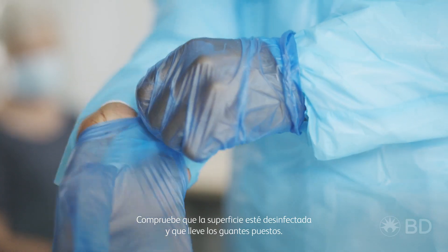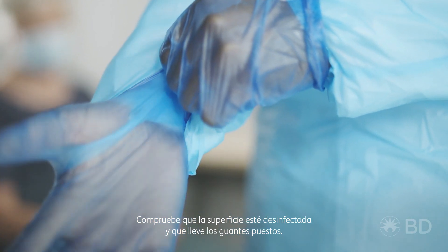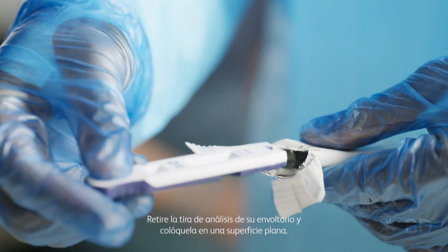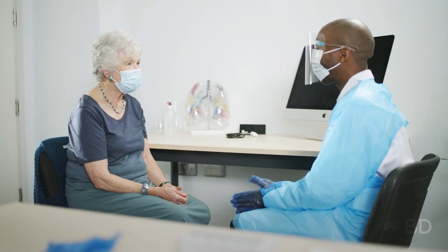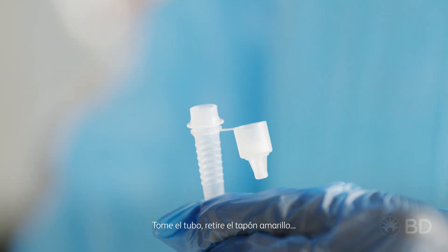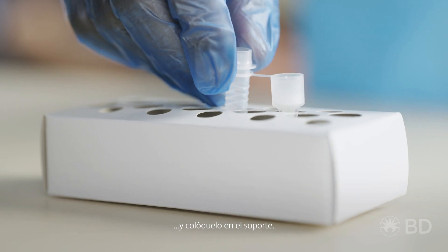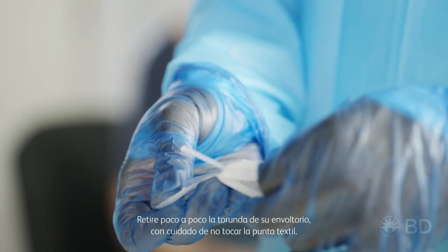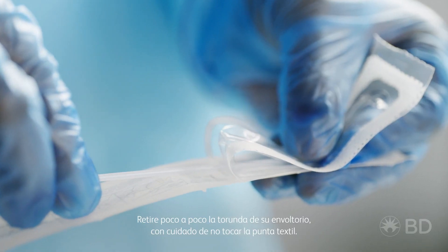Check your surface is sanitised and you have clean gloves on. Remove the test strip from its package and place it on your flat surface. Take the tube, remove the yellow cap and place it in the holder. Gently remove the swab from its package, being careful not to touch the fabric tip.